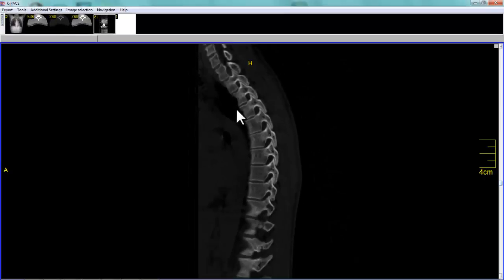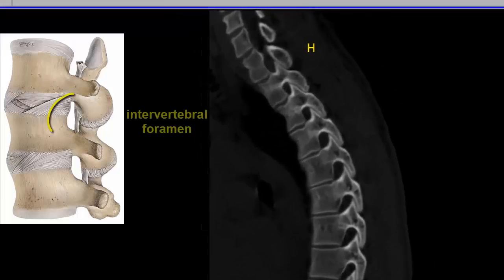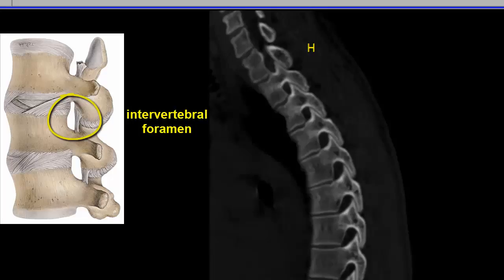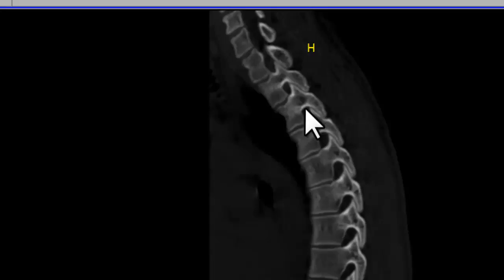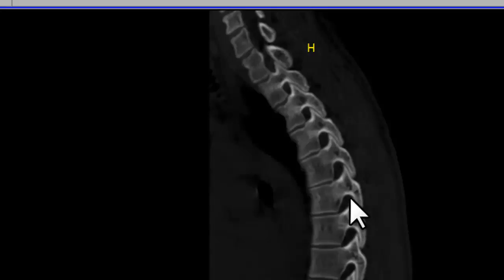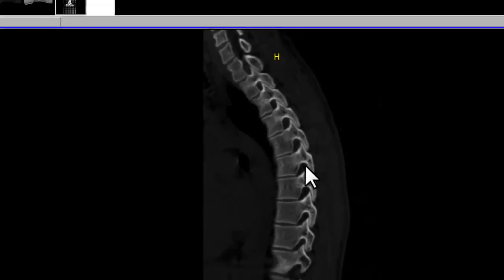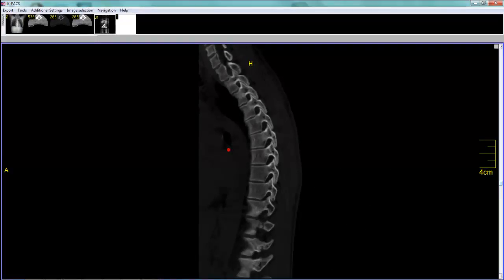The other structure you'll see nicely in the parasagittal view is your neural foramina, where your nerve roots exit the central canal. Here is a neural foramen, and the nerve root is exiting at this location. There's one nerve root to one neural foramen. There's one more neural foramen here, another neural foramen, one more neural foramen, and so forth down the thoracic spine. They are all normal in this patient.